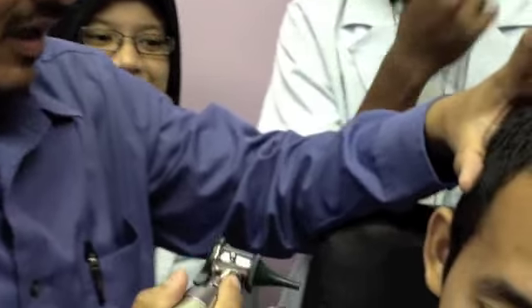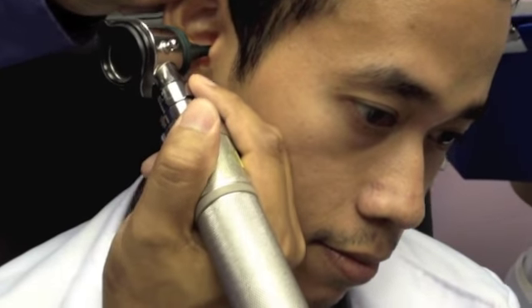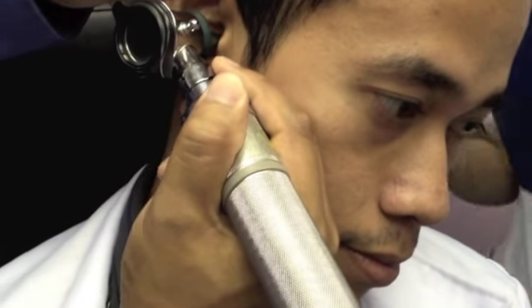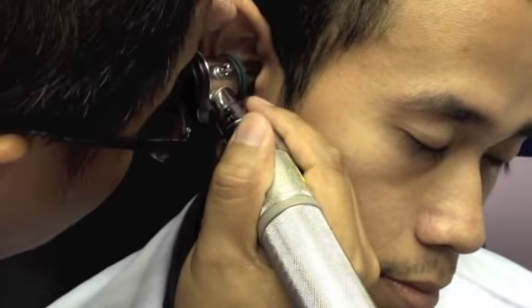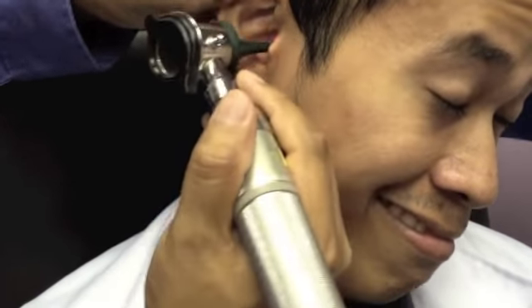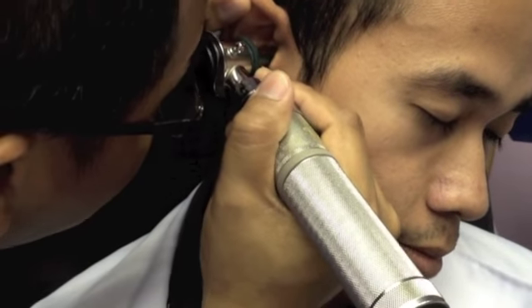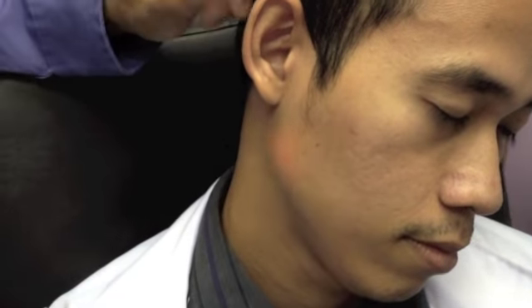There's 3 steps. Okay. Now you tilt the head, whatever you want to do. Angle yourself. Then you snuggle this thing nicely in the ear. Alright. Don't move. You go into the eyepiece and have a look. Look. Cannot see. Then you move the pinna. Still cannot see. Then lastly you move this one. See? If you moved this one earlier, it would have moved already. You understand? So you go like this. Look. Cannot see. Then you move. Cannot see. Then you move this. You understand? That's how you do it. Don't go like that straight away.